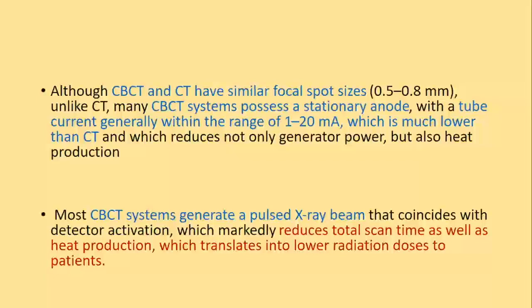Also, just to let you know that CBCT systems work with something called a pulsed X-ray beam. It's not like a one shot. And why should you know that? It's for those people who have doubts: does CBCT cause a lot of radiation exposure? Not really, not as comparable to CT, because the X-ray beam is pulsed. So you have those gaps in between where there's no exposure. That pulse exposure will ensure that the patient's radiation is low.